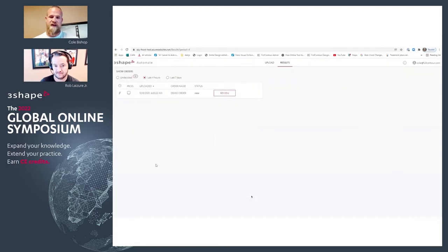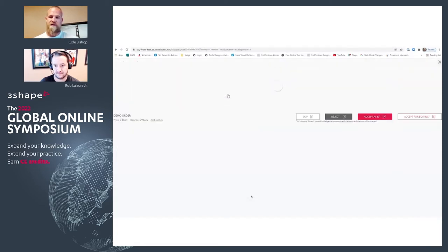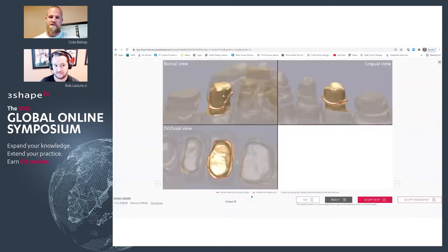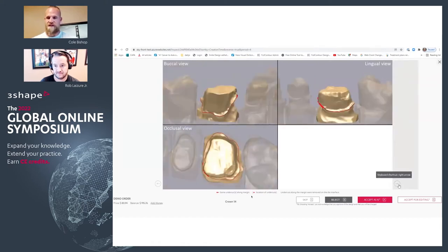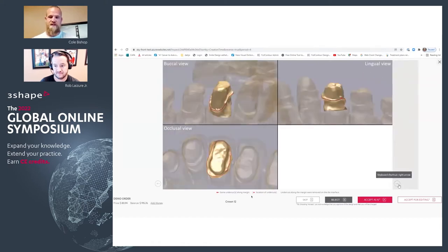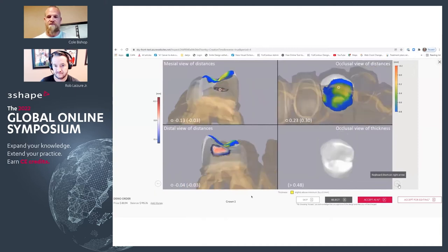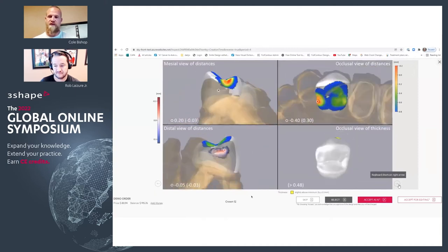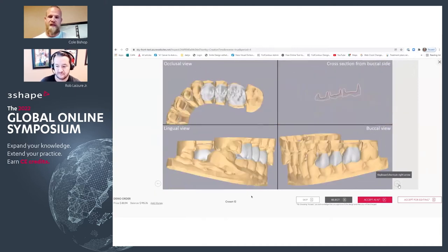Once that case is ready inside of Automate, you can hit Review. This is going to give you all the different screenshots related to your margins, your contacts, your occlusion — give you a really good idea of where everything is looking.